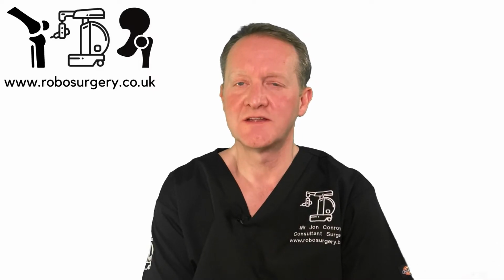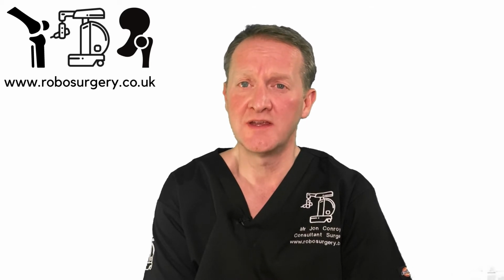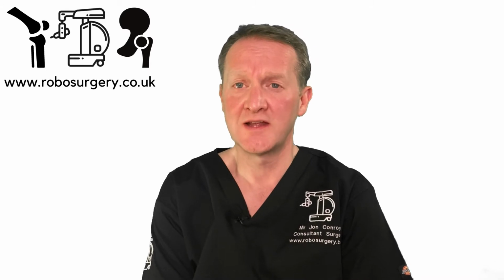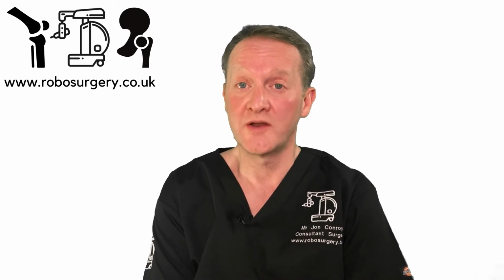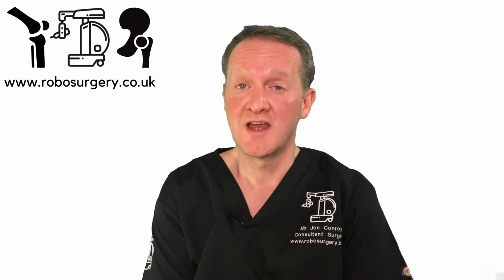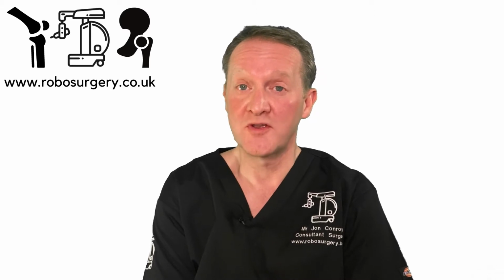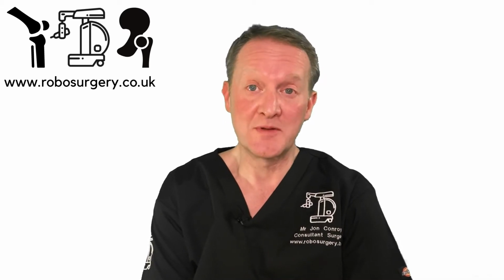Every patient has different surgical anatomy. We learn this over several years of surgical training. Most patients, the anatomy is not too variable, but we do have some patients where the anatomy can be quite a range from normal. They can have large defects, abnormal hip shapes, they can have previous surgical abnormalities.